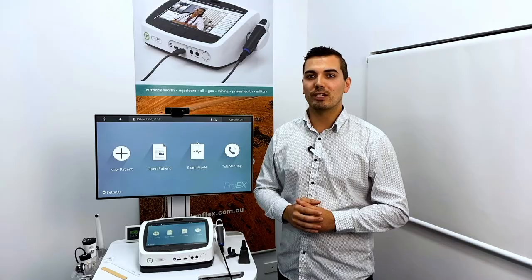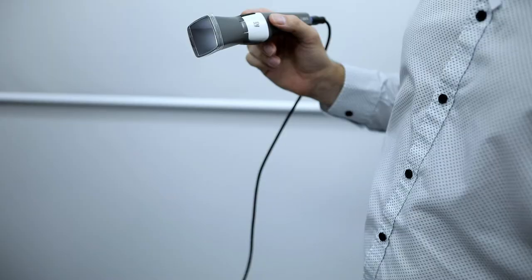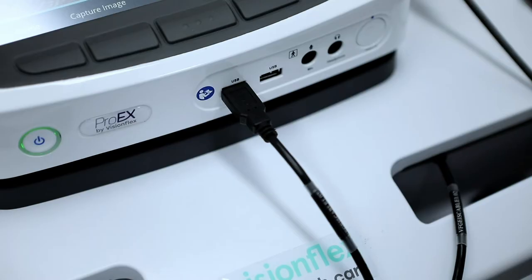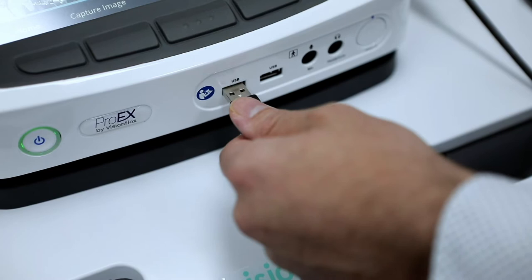The manual focus mode can be very useful when looking at parts of the body where there is not much contrast, for example the palm of your hand or inside the mouth. To return to autofocus mode, simply disconnect the GEIS camera and then reinsert it into the USB port.